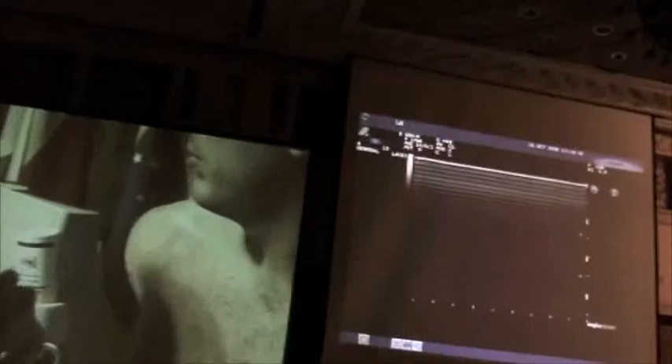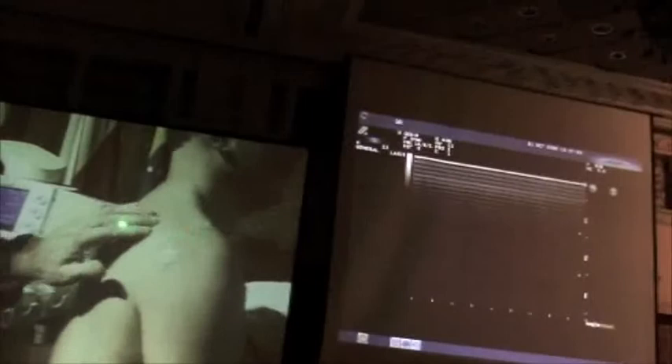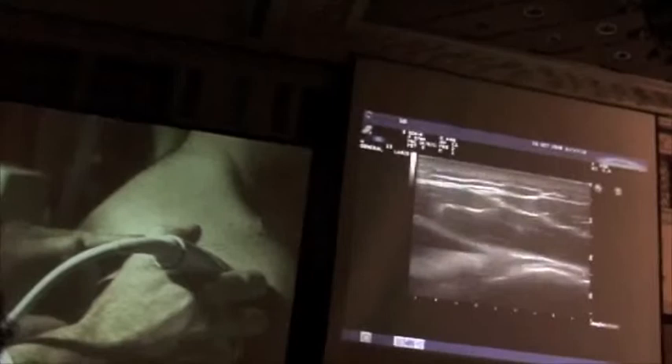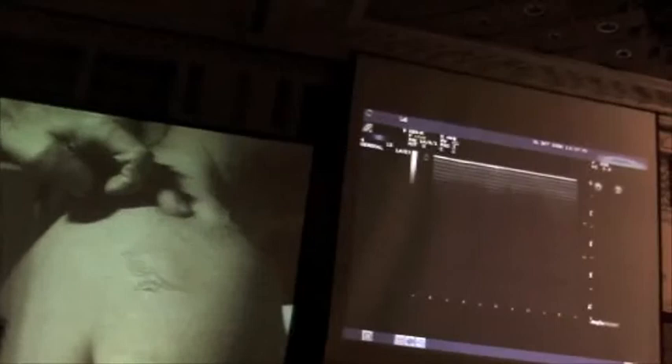There's one last thing we always check on every shoulder. Looking at the back of Federico's shoulder, I feel the spine of the scapula — it runs from medial inferior to lateral superior. We showed you before the infraspinatus tendon below the spine of the scapula — that's the infraspinatus tendon. Now if I scan above that spine, let's just look at the spine of the scapula.